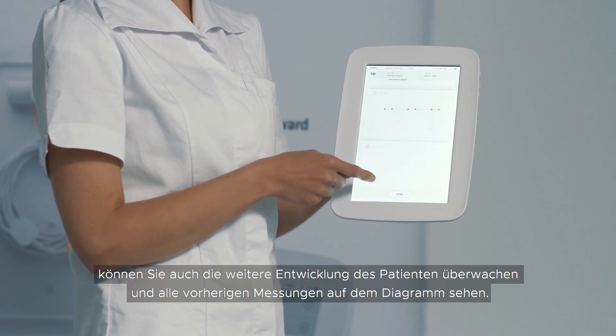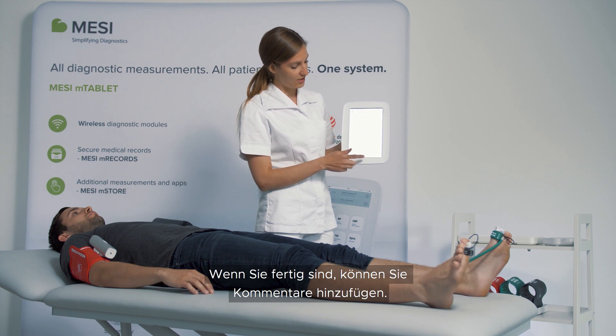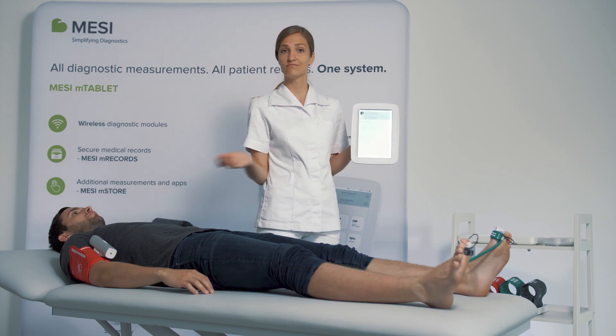You can monitor the patient's trends and you can see all the previous measurements on the graph. You can add any comments and you're done in a minute.